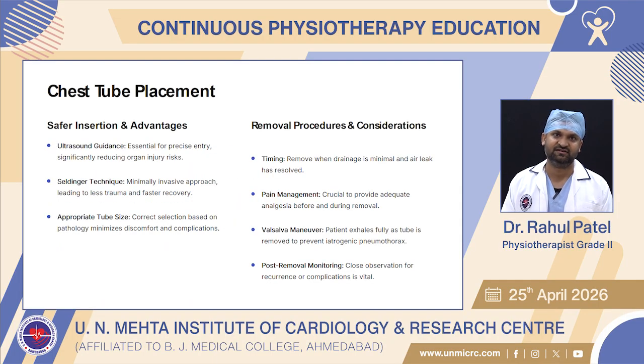Chest tube placement. Safer insertion and advantages. Ultrasound guidance is essential for precise entry, significantly reducing organ injury risk. Seldinger technique, a minimally invasive approach leading to less trauma and faster recovery. Appropriate tube size, correct selection based on pathology, minimizes discomfort and complications.